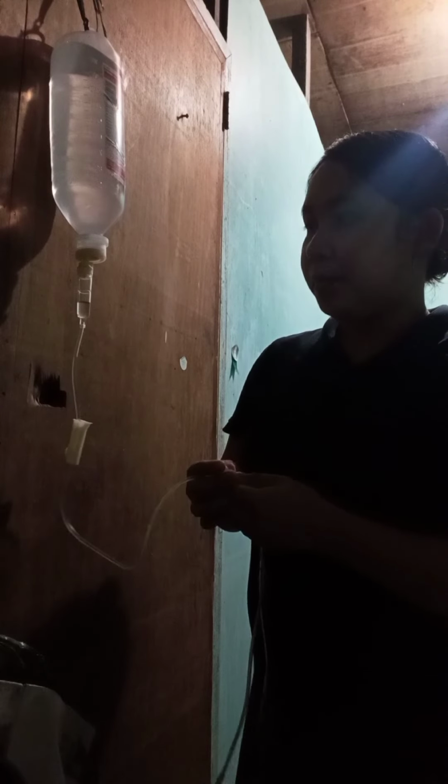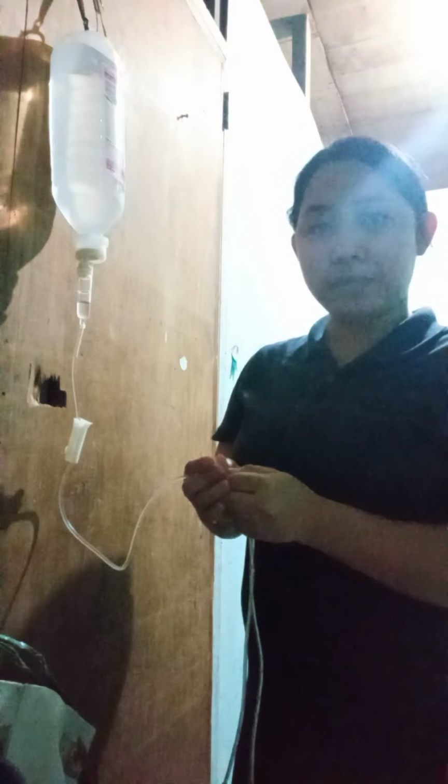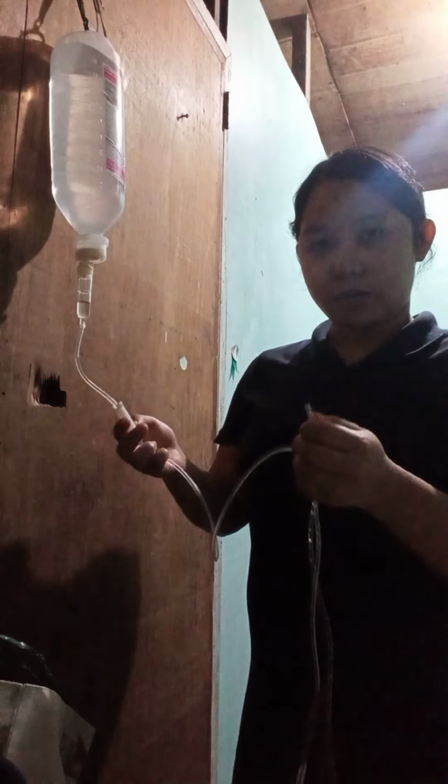Fill the chamber at least half. Then, prime the tubing to eliminate air in the tubing. As you can see.